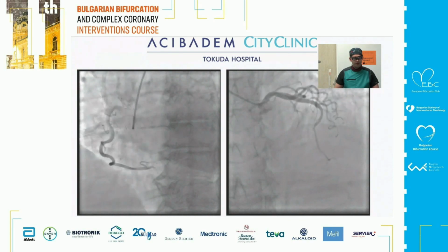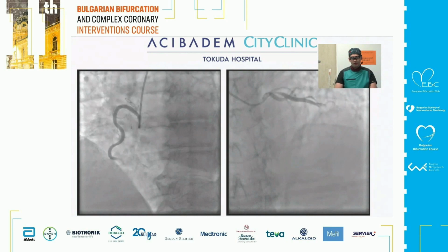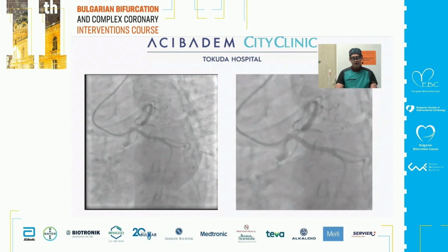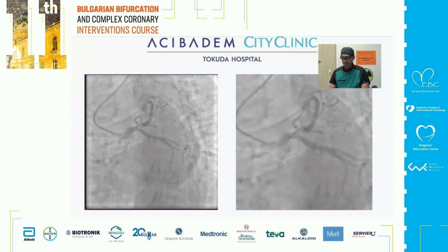Here you can see the film: the right coronary artery is normal, and there is one ostial severe stenosis of the LAD. This is the first case.